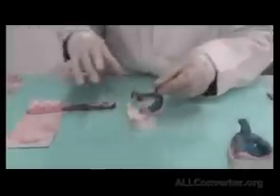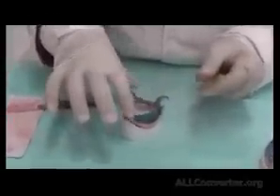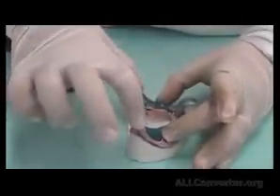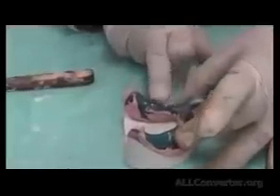We center it over the cast that has been applied with Vaseline. We first seat into location before pressing. We make sure that we are correctly located. And what I want you to really look closely at, see how once I begin squeezing, we begin squeezing usually the impression material from back to front. I want you to see how the zinc oxide eugenol is squeezed out of the hole areas. See how it's going out of the holes? Okay. This reduces pressure on these areas.